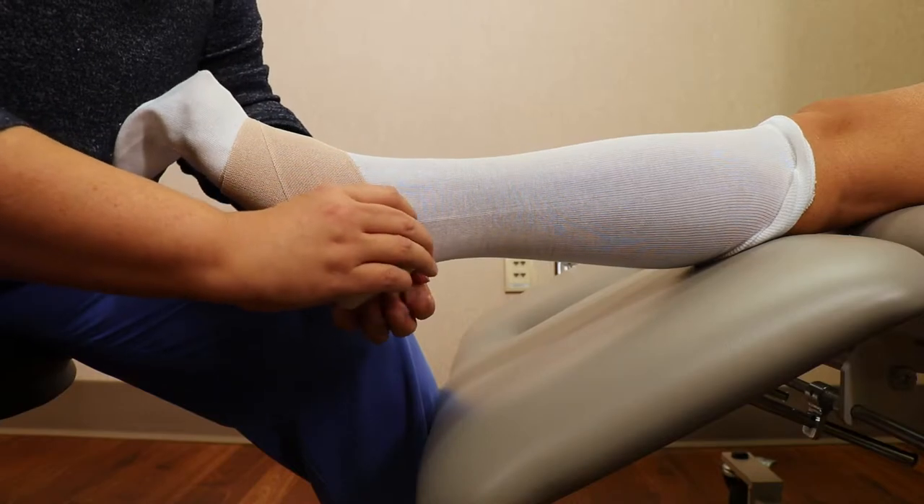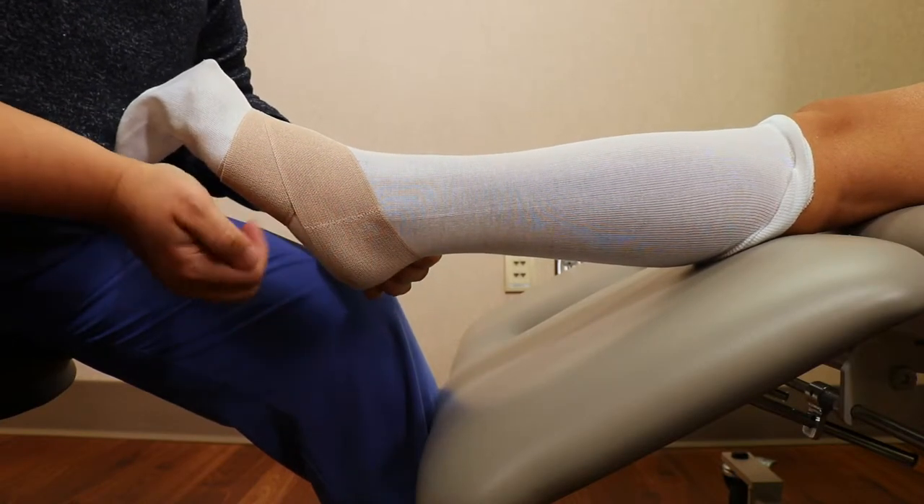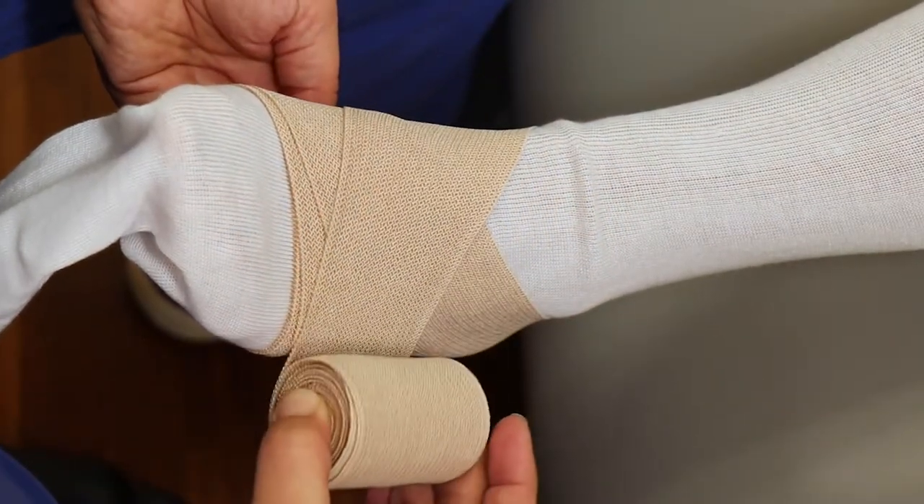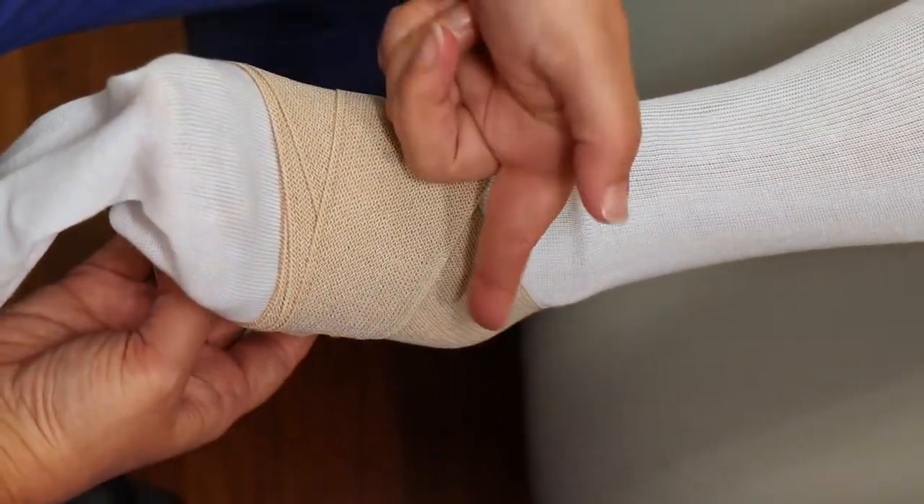take the bandage behind the heel, pretty low on the ankle, and then down across the top of the foot to make your X.